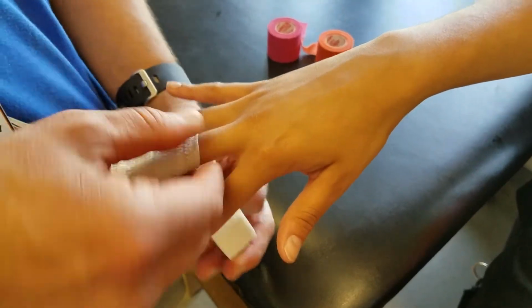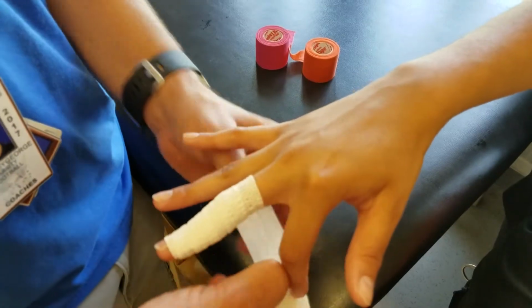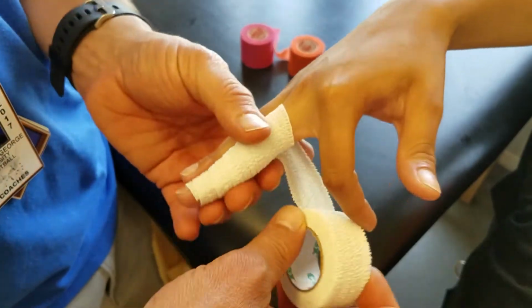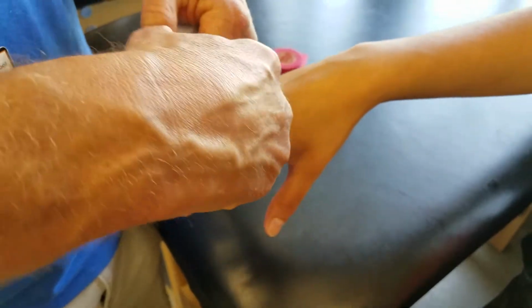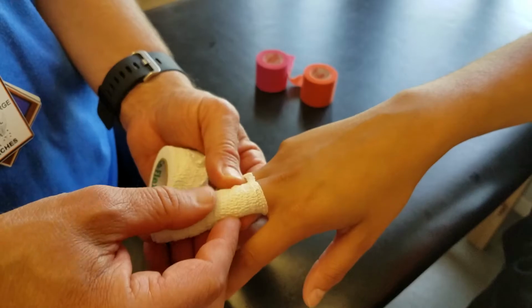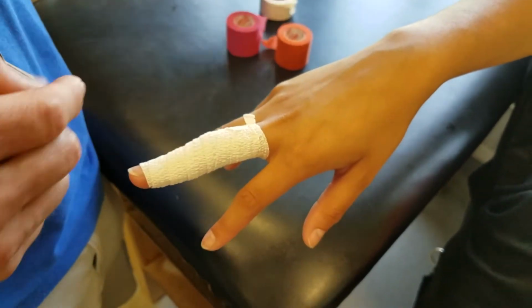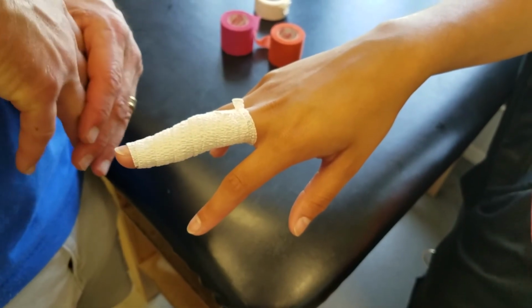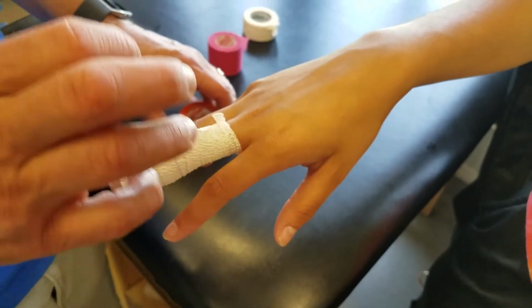Basically what I'm trying to do is get a little compression and force that swelling back in the proximal direction. If you get this wrap on, let's say Coflex like this, and it's too tight, I always tell the athlete to let me know if their finger starts to tingle at the tip, or they can't feel it. I just put it on as a light compression wrap, and I'll tell them to wear it for 24 hours. Come back the next day, don't take it off. You can get it wet. You can even soak it in a cold bath or cold water to do treatment with that compression wrap.